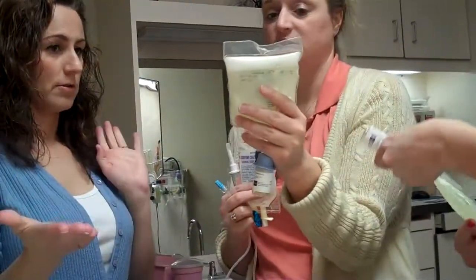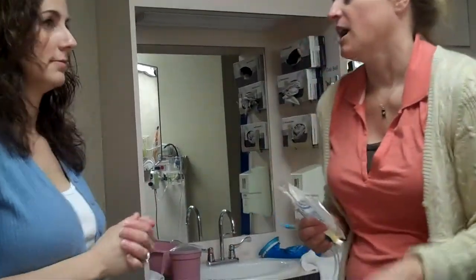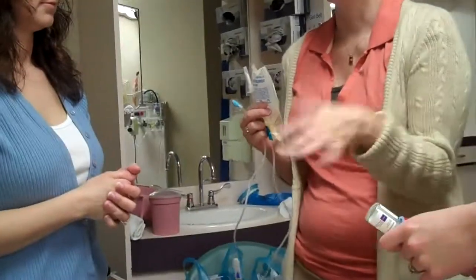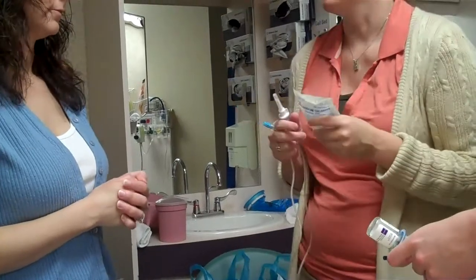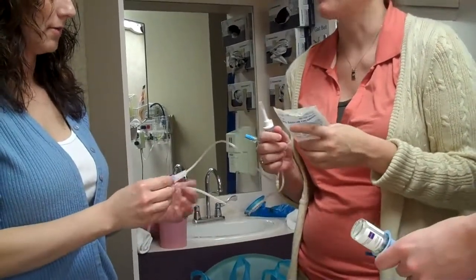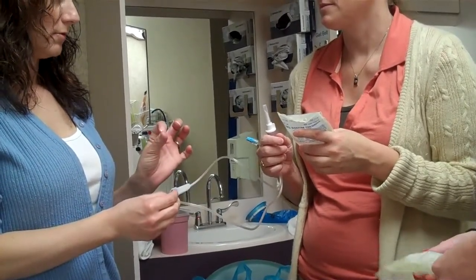Is there an order in which I have to give them? No, but I would establish an order. I would do the Dapto first, it's quicker, and then I would do the Gent next. You can do them back to back, but you'd have to flush between each line. And then just squeeze it down smaller, like you said, so it's dripping slower.